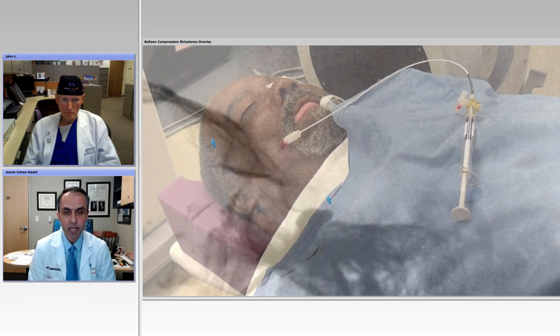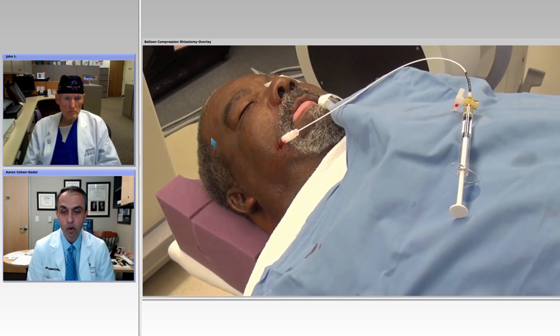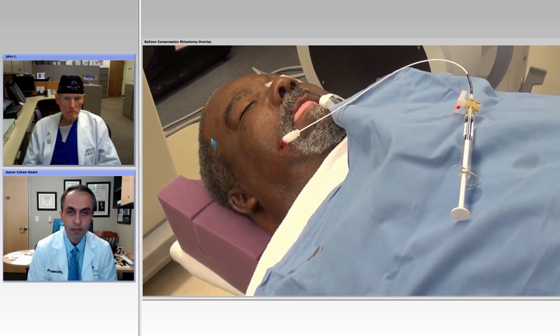I have to emphasize that if your balloon is too high, it's going to go over the petrous ridge, and you will not get a good balloon compression for the Gasserian ganglion. And that's really critical. The shape of the balloon, there have been multiple studies there. You don't want to be too high. That could also potentially cause double vision by compression of the nerves in the cavernous sinus. You want to be as close to the skull base as you can, but not so close that your balloon would not inflate.